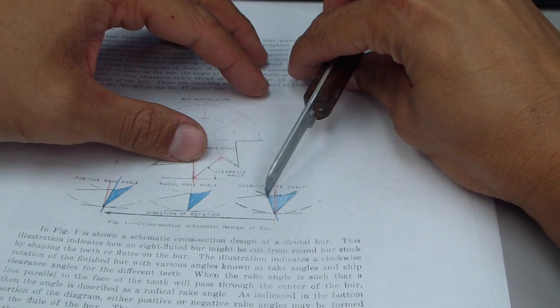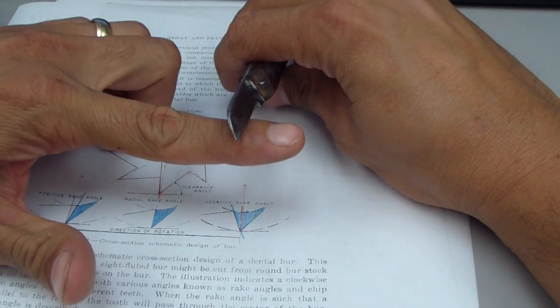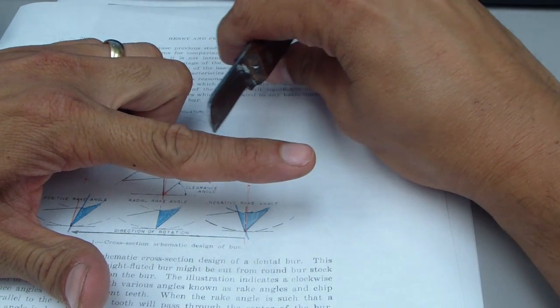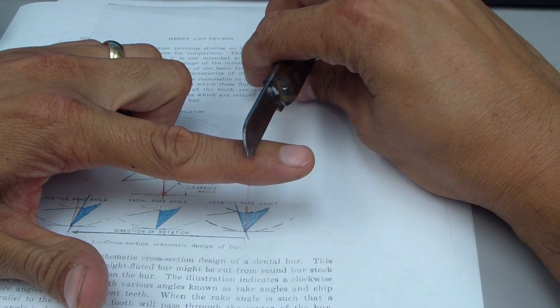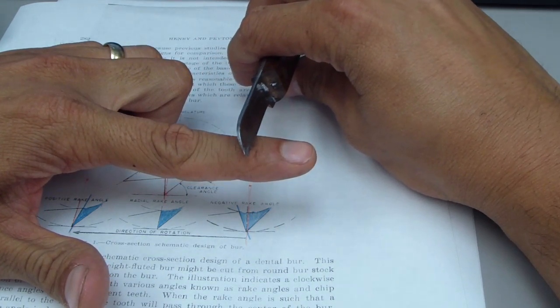Versus a negative rake angle which has more material as you can see here in the design. But you're getting more of a scraping motion relative to the path of travel. So it may be smoother, it's not going to cut as efficiently but it might actually last longer.